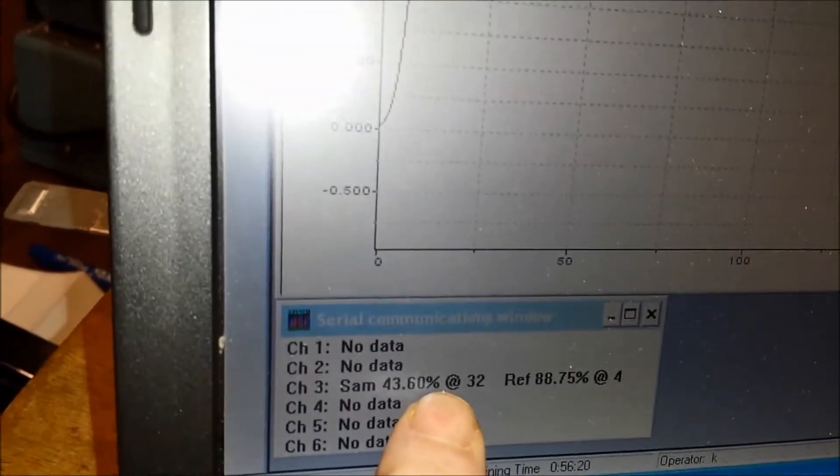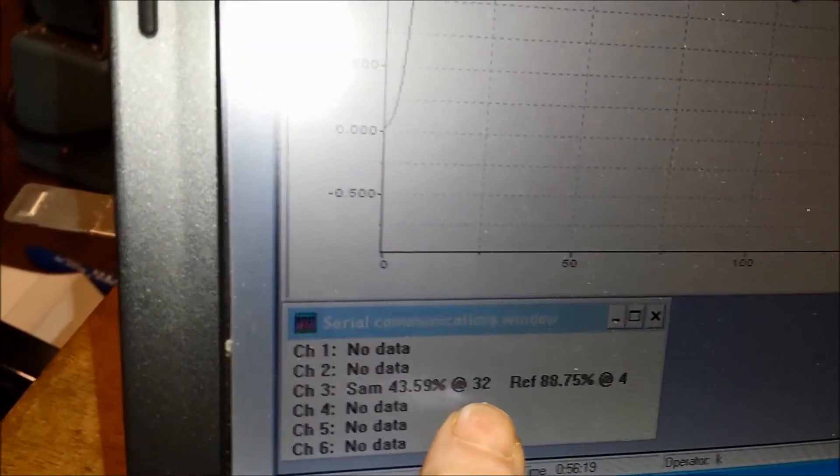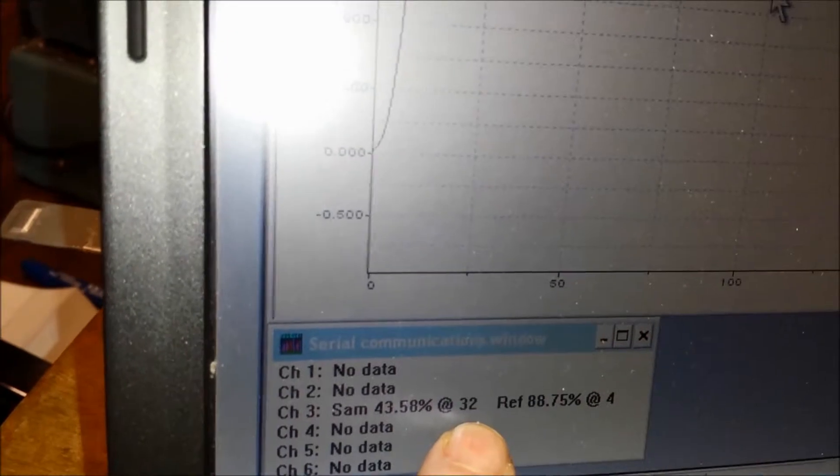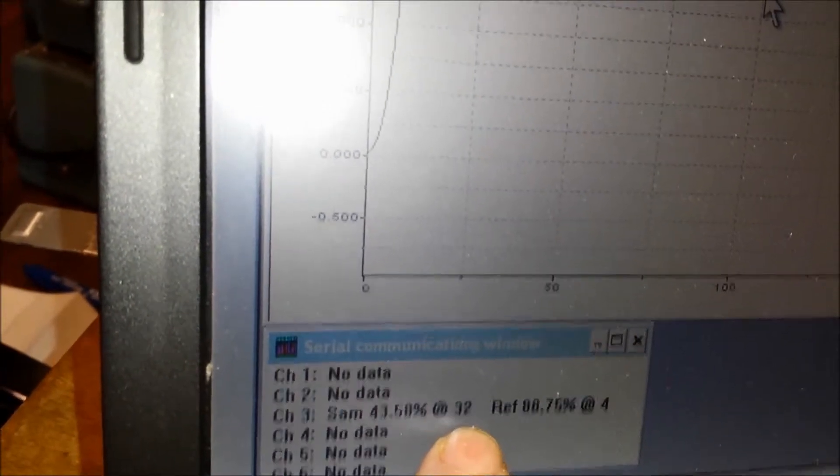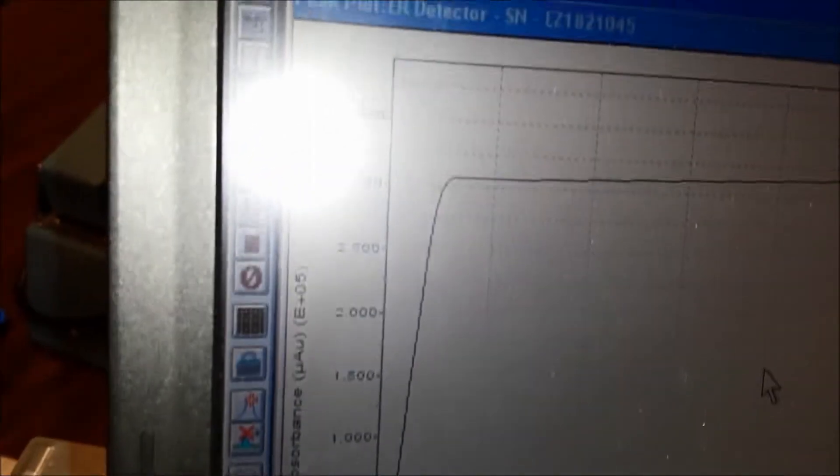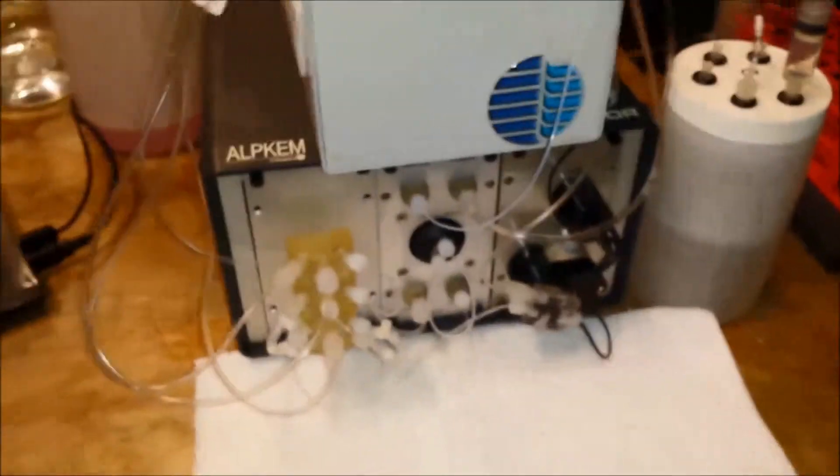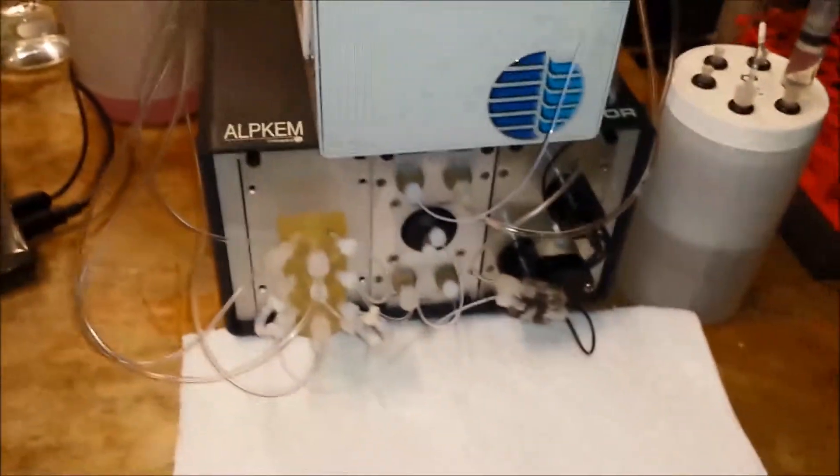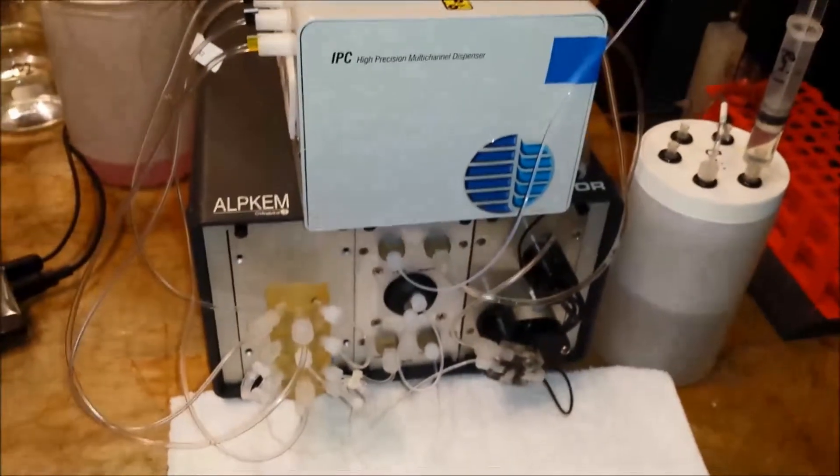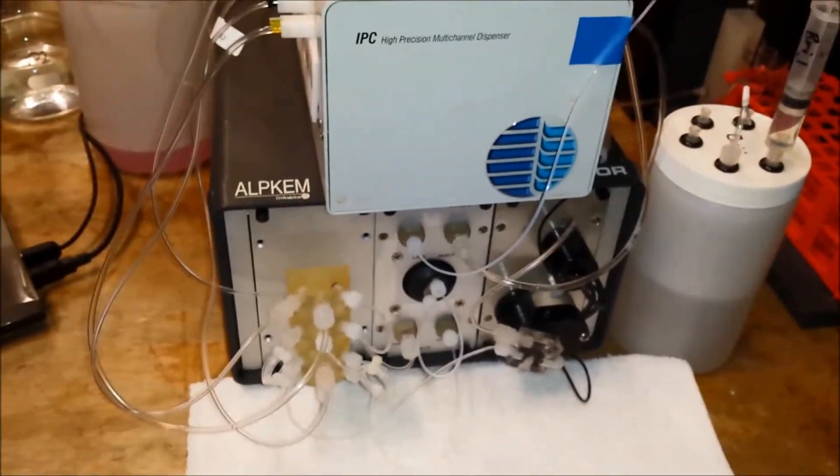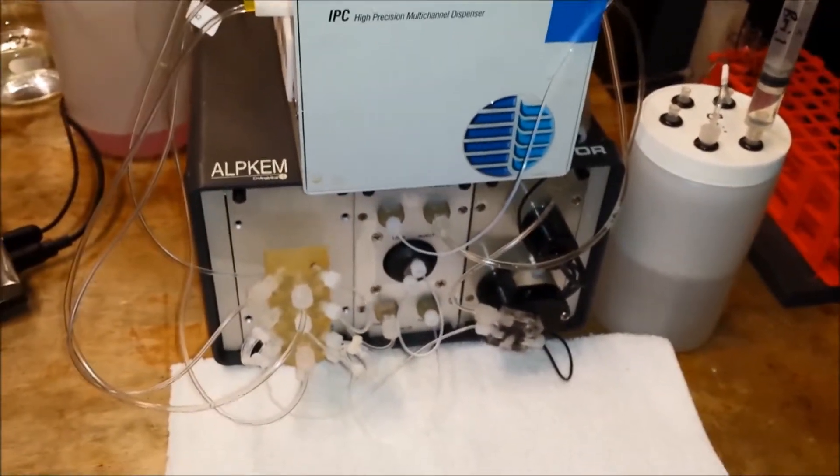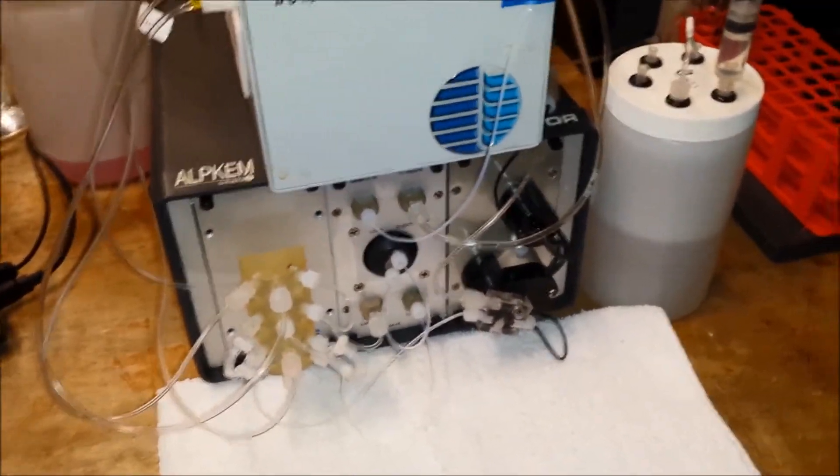Right now we have a flow cell that has a problem in the gain setting of the sample side, and you can see that the baseline has risen and is quite high. We have a bubble in the flow cell. Occasionally you might have this problem with bubbles, particles, or many different things.